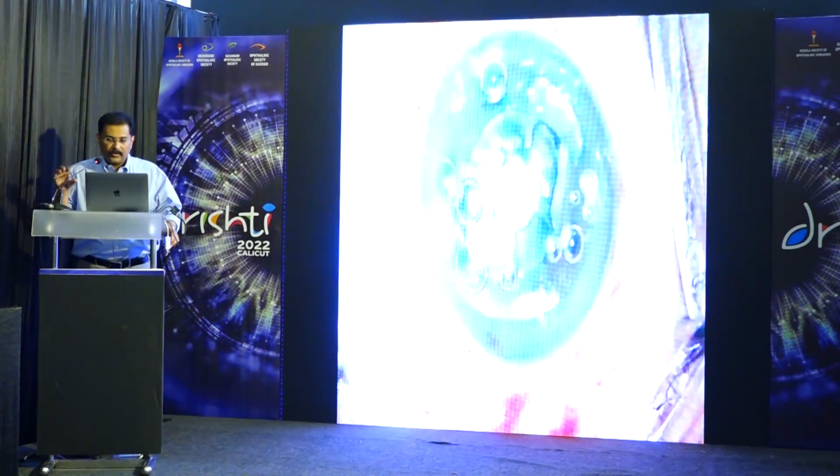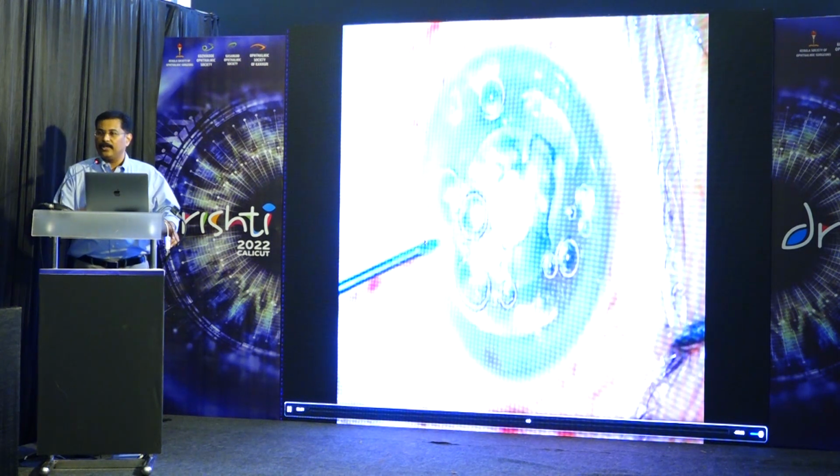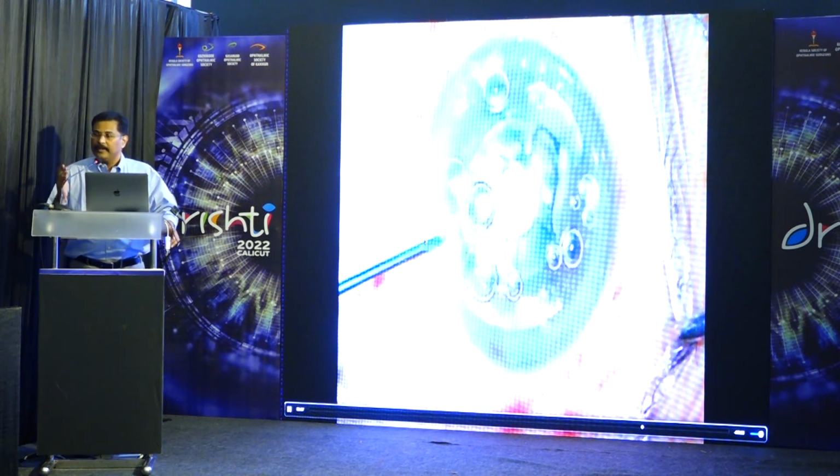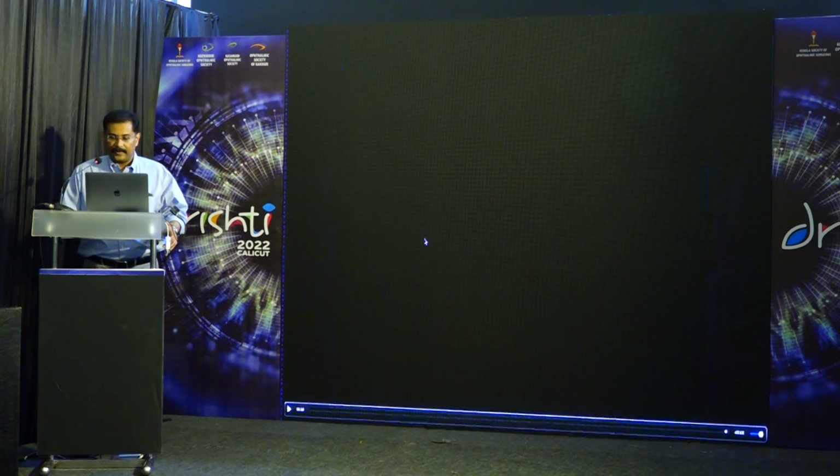Sometimes it looks very difficult. Here again, this is a classical example of a large arcus, and you hit on it, it never opens. If it is a very large arcus, it is just out of the question. It doesn't penetrate through opacities.